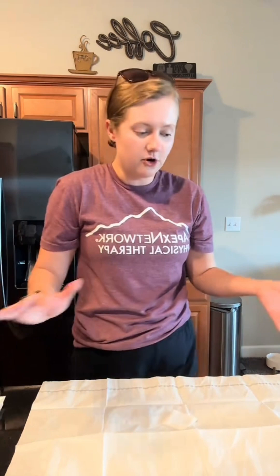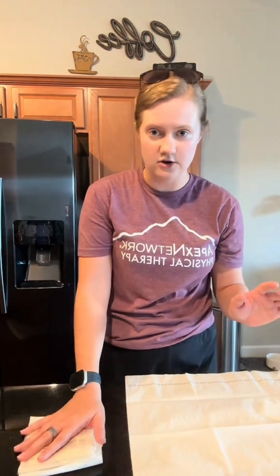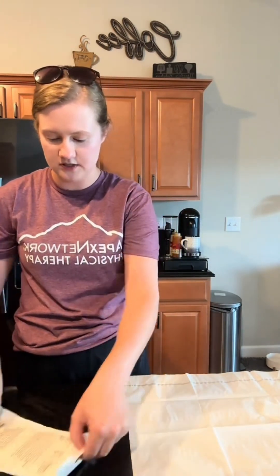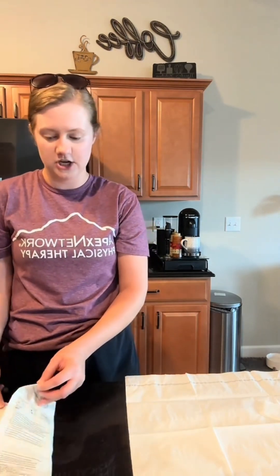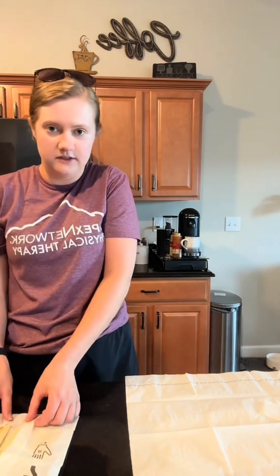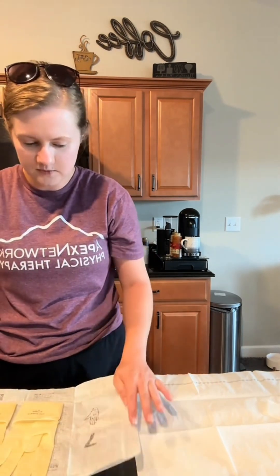Normally we would have more room for our gloves for the skills check-off, but since I don't, I'm just going to move this over. I have my sterile gloves here so I'm going to open these up — just like my sterile field, I can only grab that one-inch outer border. These have been opened before since I've been practicing. I'm going to lay that flat.